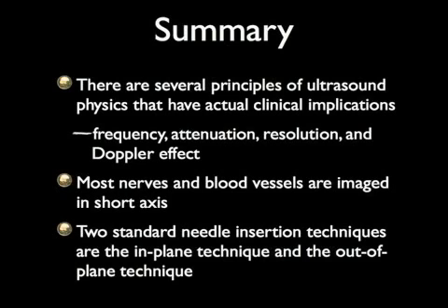In summary, there are several principles of ultrasound physics that have actual clinical implications. These include frequency, attenuation, resolution, and the Doppler effect. Most nerves and blood vessels are imaged in short axis. Two standard needle insertion techniques are the in-plane technique and the out-of-plane technique.